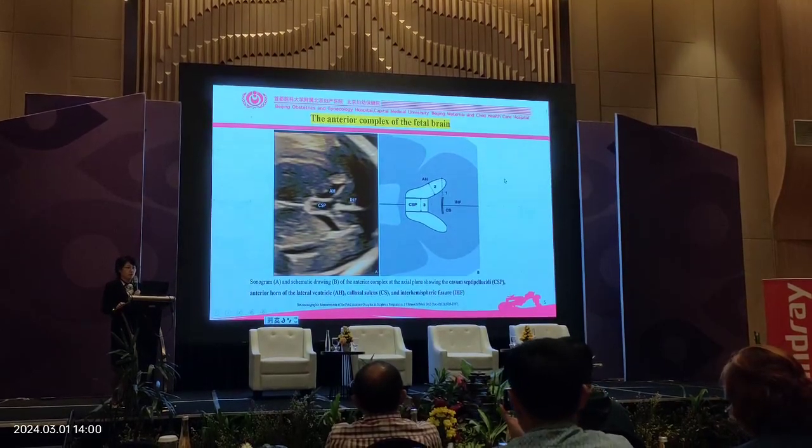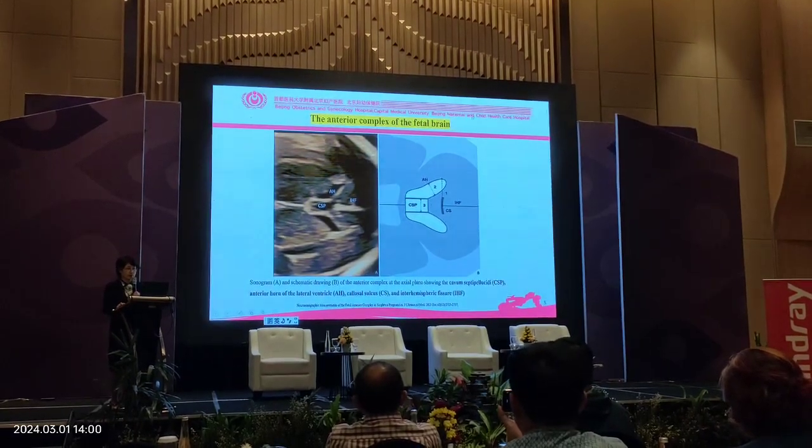First, I will focus on the anterior complex of the fetal brain.